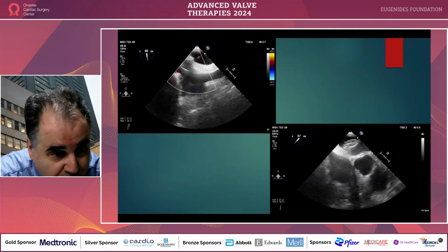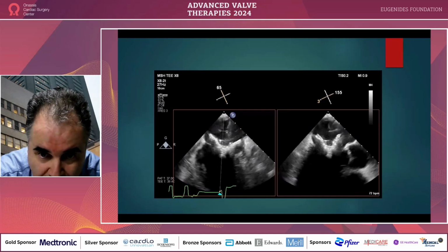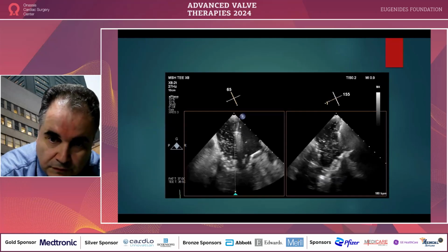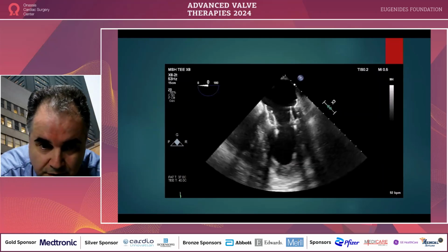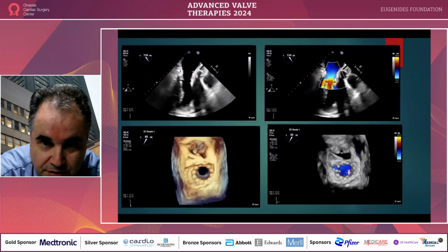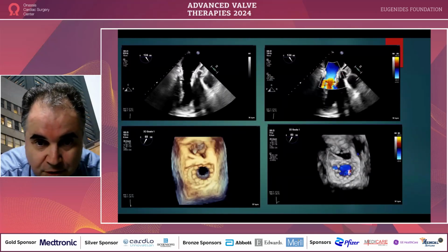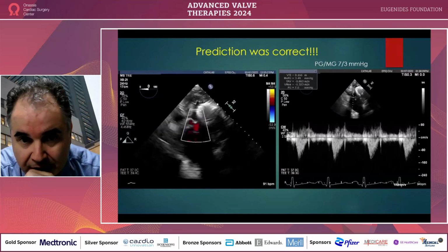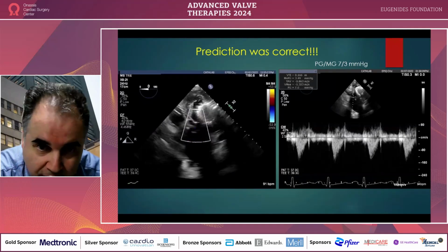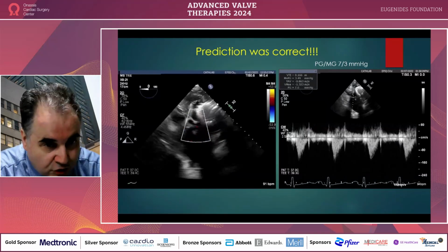Crossing of the septum, ballooning the septum. And this now is the valve, ready to be deployed. Here is deployed. Sorry for this, too many movies. But anyway, a great result, and this is the gradient through the LVOT, as you can see, mean gradient of 3, peak gradient of 7, and as per the neo-LVOT there was no risk for LVOT obstruction in this particular case.